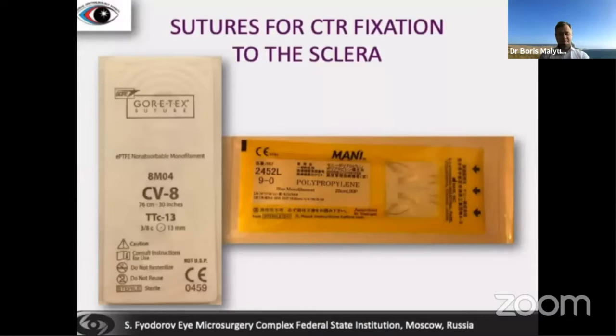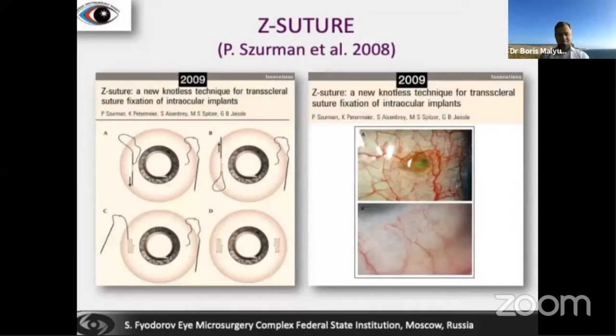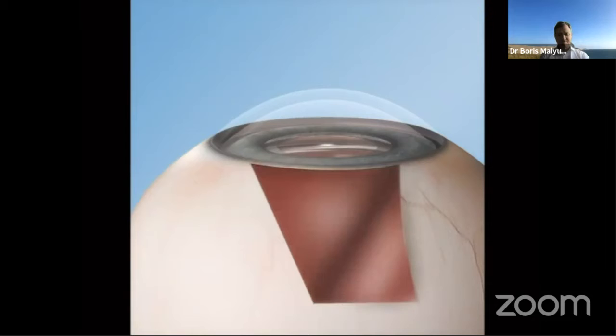Over the years, my preferred suture was 9-0 polypropylene. However, quite recently, Gore-Tex was also introduced into my clinical practice. With polypropylene, having both ends of one suture attached to the same needle, forming the loop, it is quite easy to use the cow-hitch type of suture attachment to the eyelet of the CTR. After exiting the eye, the suture is fixed to the sclera with the zigzag technique proposed by Peter Schurman. An L-shaped incision of the conjunctiva is made, and the needle is passed parallel to the limbus 4 or 5 times.